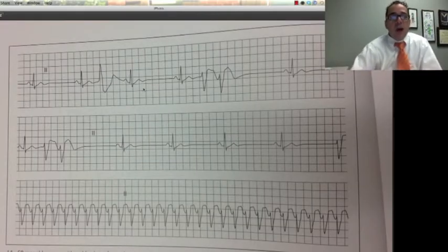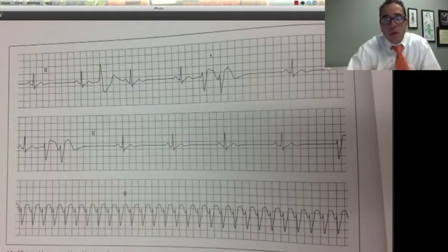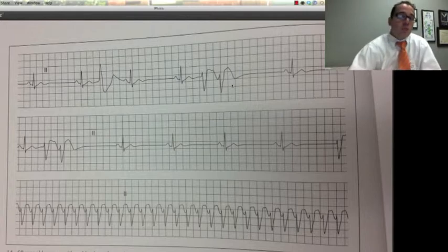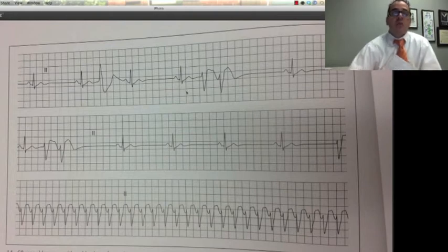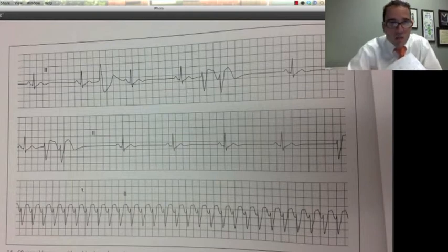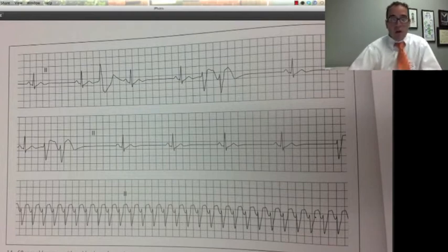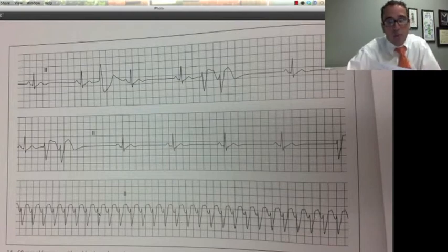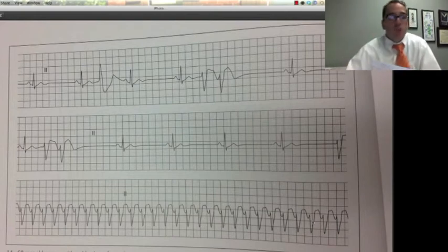Here you have a sinus beat, sinus beat, premature contraction, sinus beat, sinus beat — kind of slow — and two premature contractions. These two premature contractions are different from this one, meaning multifocal premature ventricular contractions. Then sinus, sinus, again, sinus, sinus, sinus, and then ventricular tachycardia at 180. This ventricular tachycardia is coming from the same spot, probably the same as the earlier PVC, because they're all monomorphic — they have the same shape.